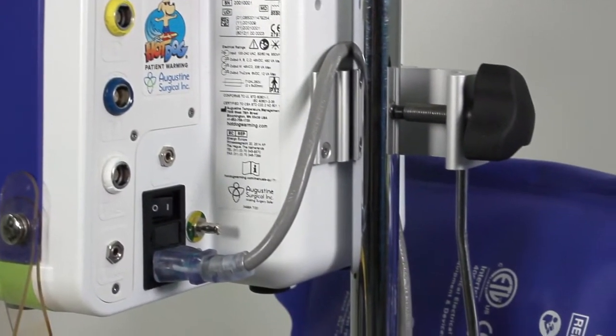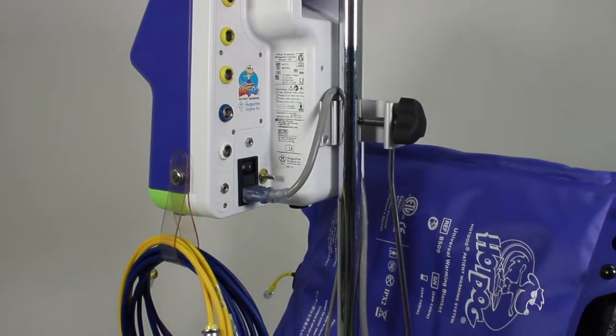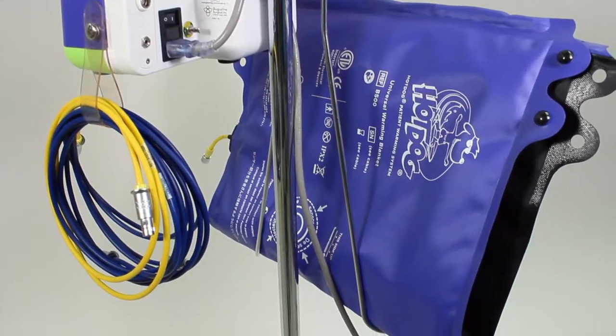The IV pole clamp also allows you to contain your whole warming system by attaching an A110 storage rack, where you can conveniently store blankets when they are not in use. The storage rack is sold separately.